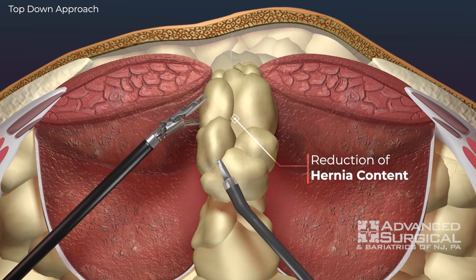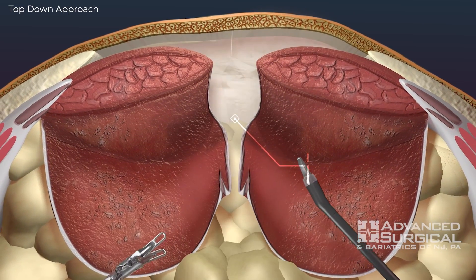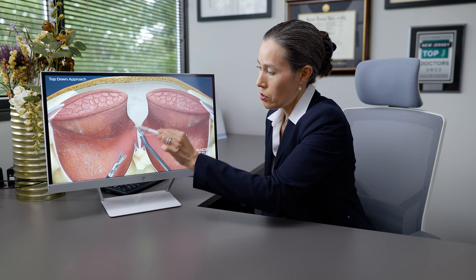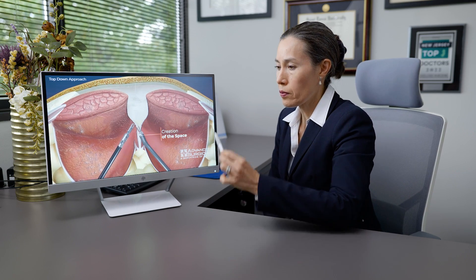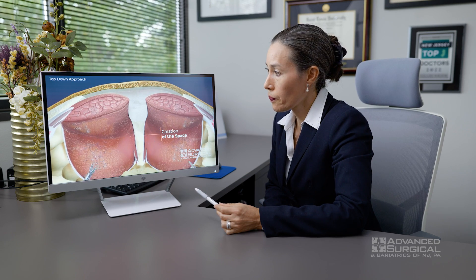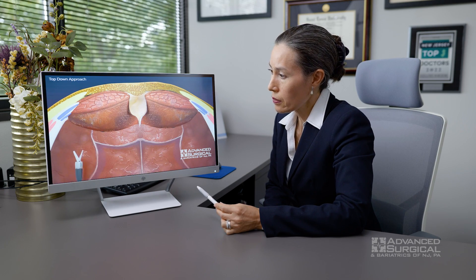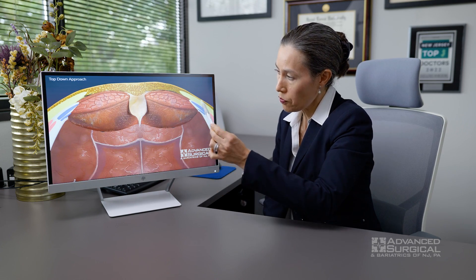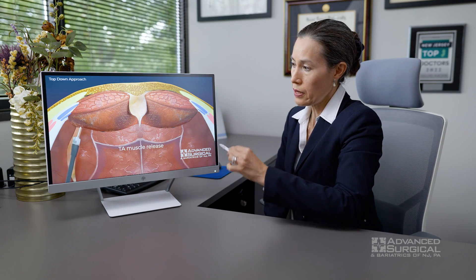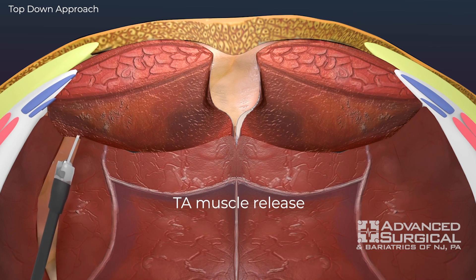There's a lot of dissection that needs to be done. After we reduce the hernia contents out of the hernia defect, we'll complete the dissection to get the complete delineation of the hernia defect itself. Once we're done with that, if needed — especially for larger hernia defects — we can do a muscle release.